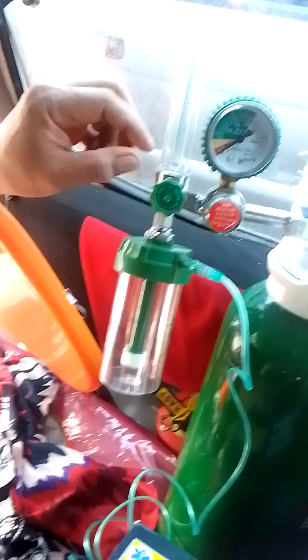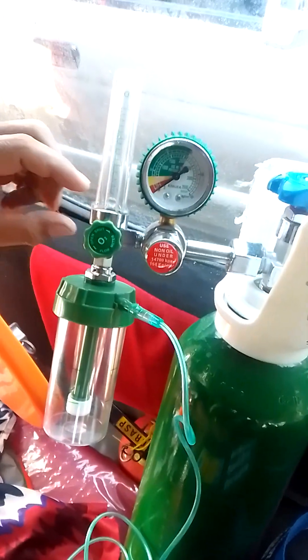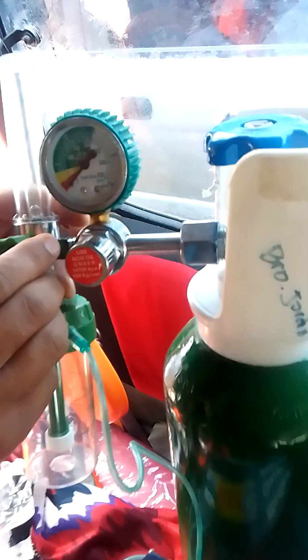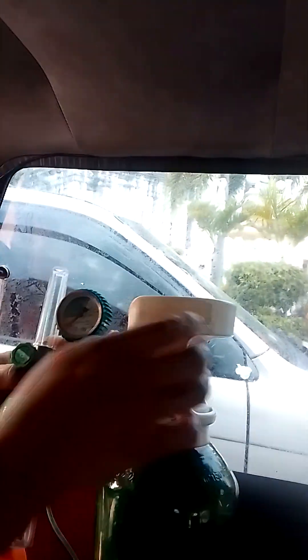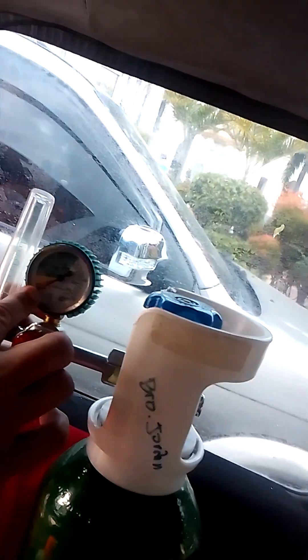Range it to number 2. Number 2 is right here in the middle — not too high, because otherwise it will suffocate the patient. Then you turn this bulb on — turn it to the right or left. Once it's turned on, you'll hear the flow.